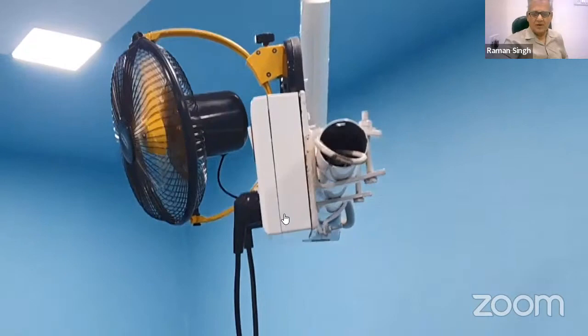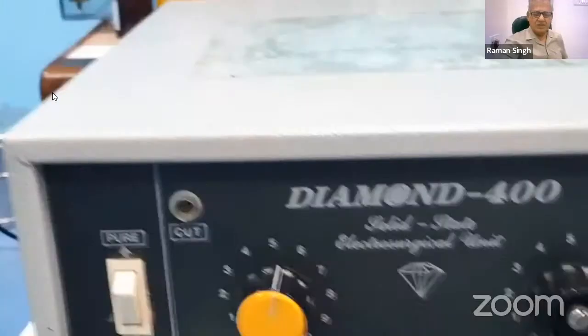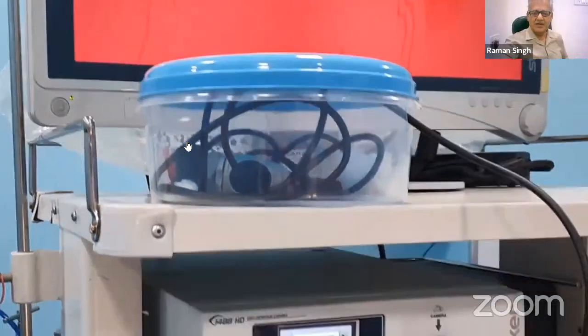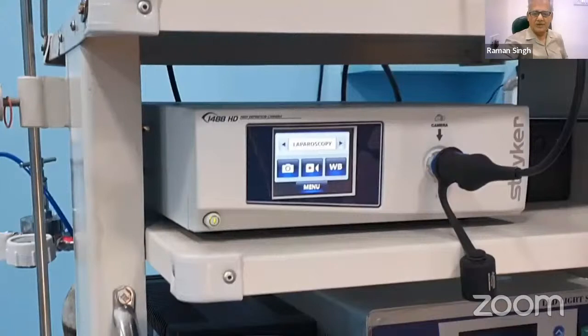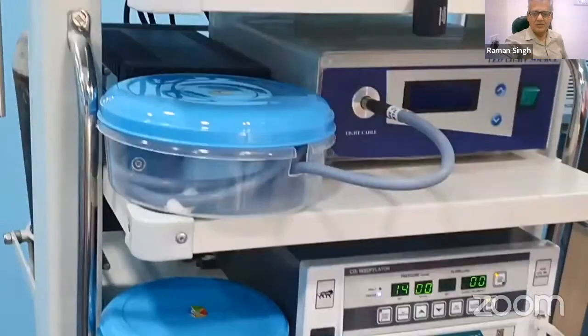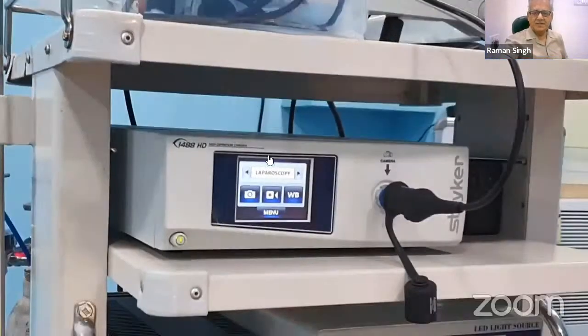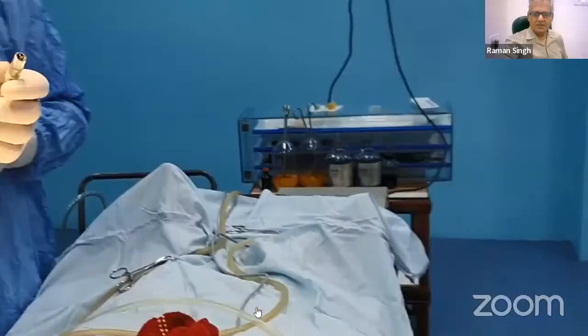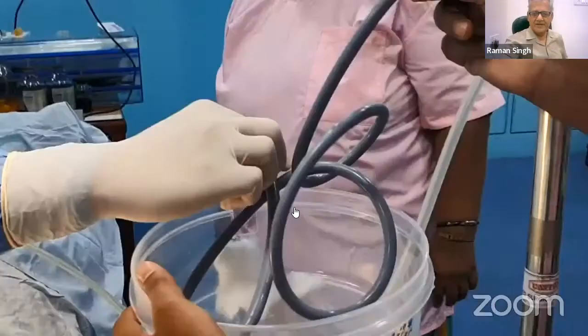These wires come from upward, because if you take the wire from here, the legs get entangled with the wire, and there is a chance of accident in the operation theater. So we put a hanger over there, and we take all the high cord or electric connections from upward, so that they are not entangled with the moving staff of the operation theater. Now this is a monitor, this is the camera, this is the CCU, this is the light source. They are all preparing, they are taking all the instruments from the cabinet.